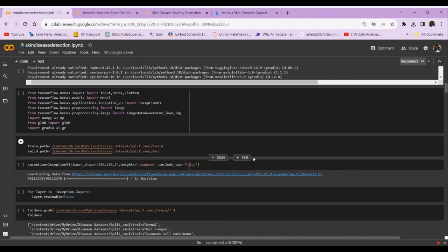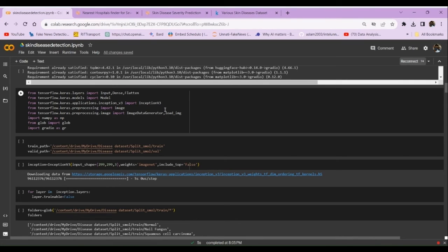For implementing the AI-based model, I used Google Colab. The AI model I am using is the pre-trained model Inception V3, developed by Google, which has already been trained on millions of images. Since it is already pre-trained, it requires less time for training and is expected to perform with much better accuracy compared to building our own model from scratch for skin disease classification or detection.